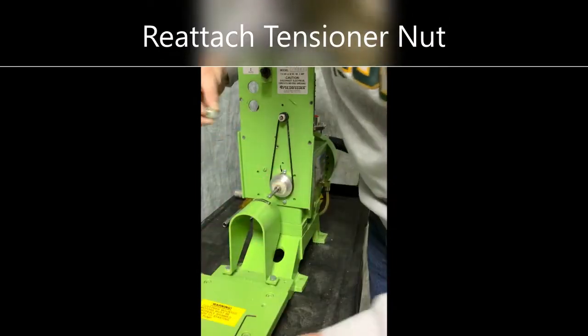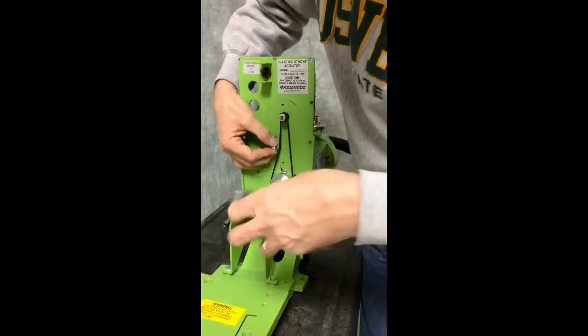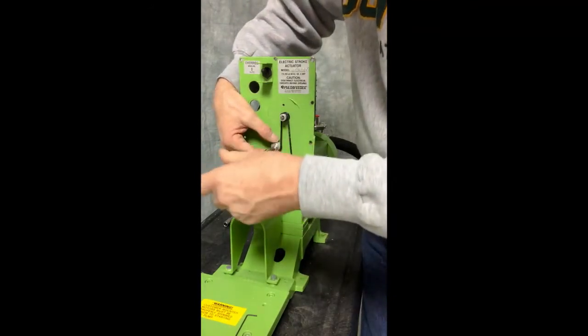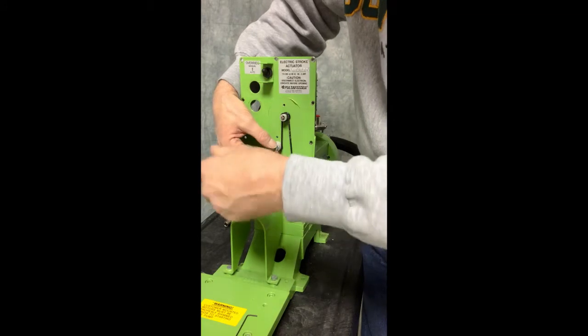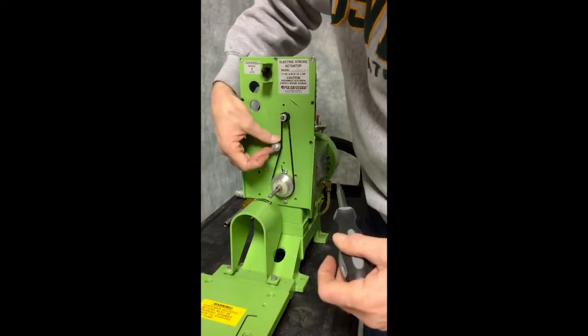Now we want to place the tensioner back on so that we will be able to keep tension on that timing belt and keep it in place. Make sure it runs smoothly.